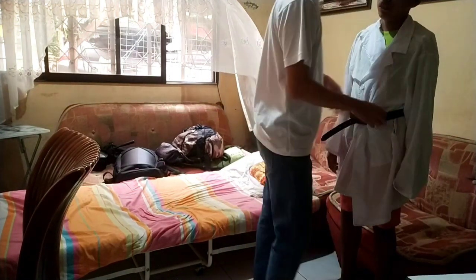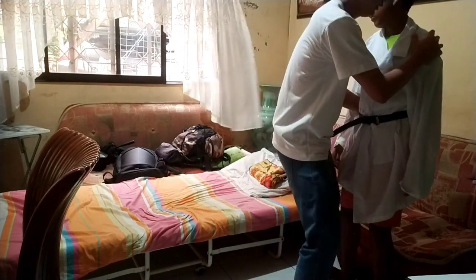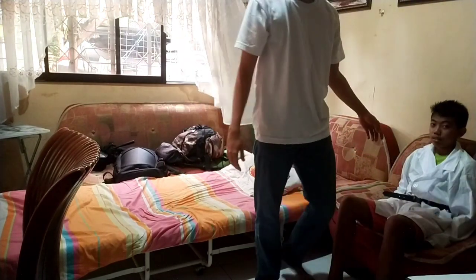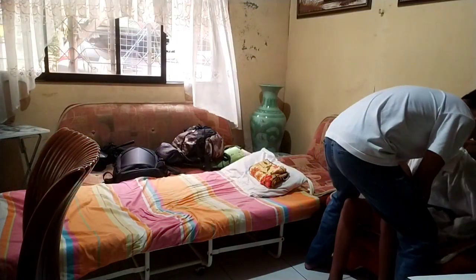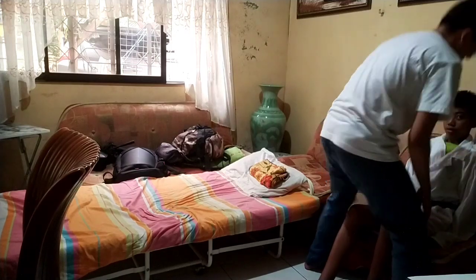So, now sir, assist, okay? 1, 2, 3, go. Can you do it, sir? Very good, sir. So after that, ensure client safety. Ask the client to push back into the wheelchair seat. So sir, let's move your back a little so you're comfortable, okay? Sir, okay na? Comfortable na, sir?